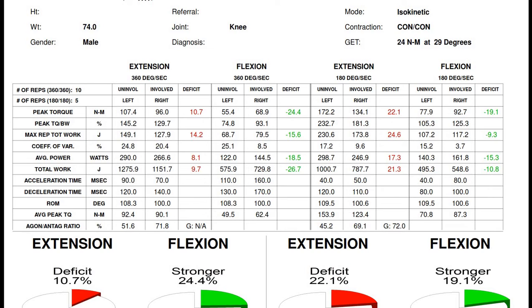This is being proposed as a useful measure of neuromuscular performance, essentially looking at how well you can get started. So the ability of the nervous system to recruit muscle fibers as quickly as possible, and then produce the necessary muscular force, which in turn generates a torque and allows the limb to move at the required angular velocity.